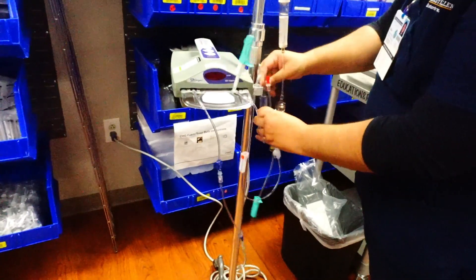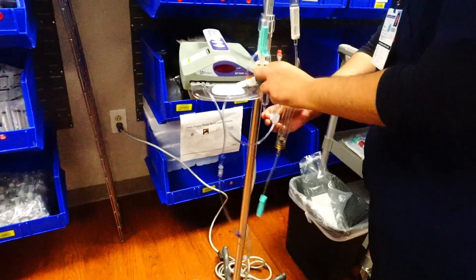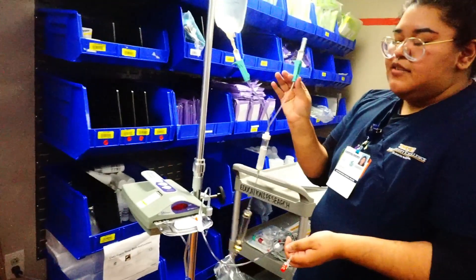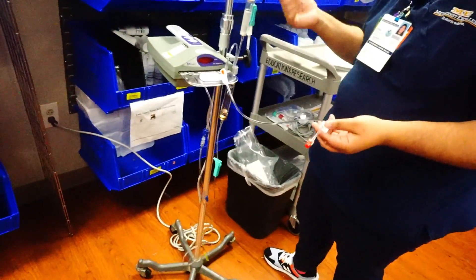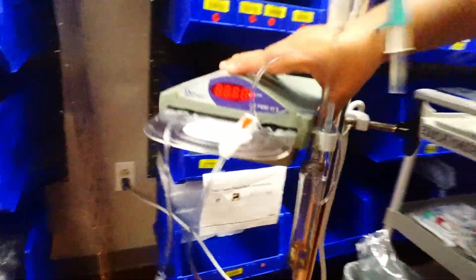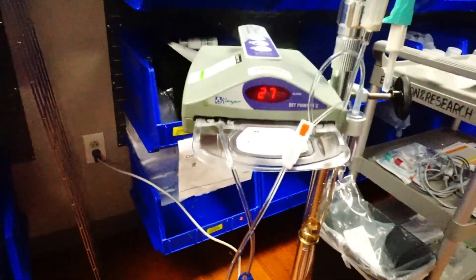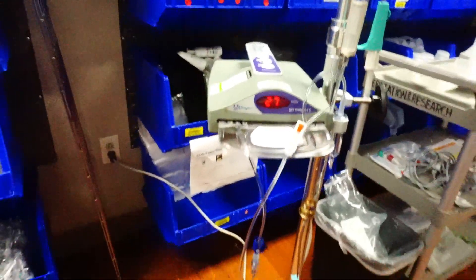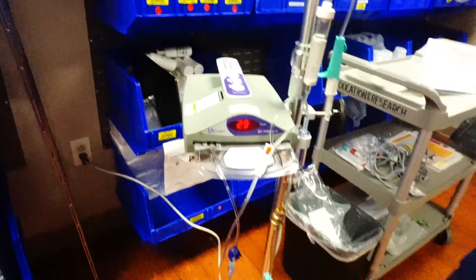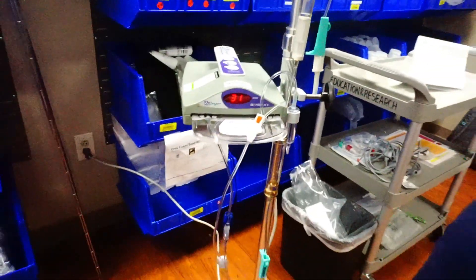Now we put the saline bag upside down in the chamber. Then all we do is connect our blood here — lock this end, connect the blood, and unlock. Then connect this to your patient and get your transfusion started. Last thing: make sure the machine is on. The on switch is on the side — just flip that. There's one setting: it goes to 41 degrees Celsius. The blood will be warmed as your patient receives it. Remember, tubing is good for two products or four hours. You can run it by gravity or pump it in if you're giving it very rapidly. And that's how you set up your blood warmer.